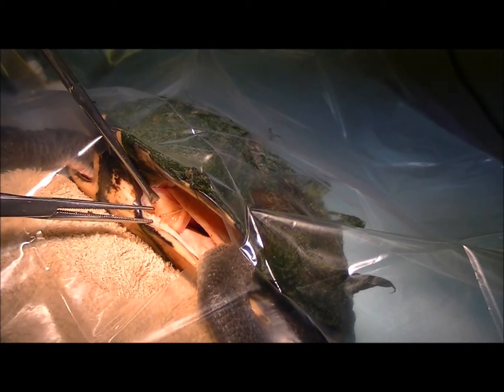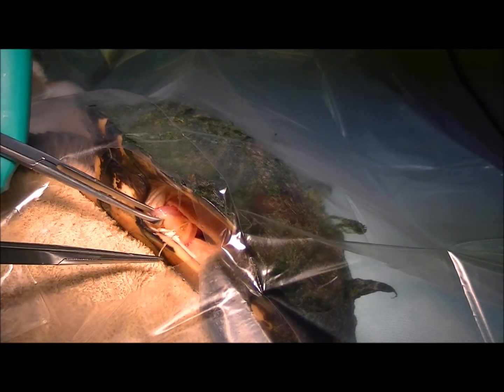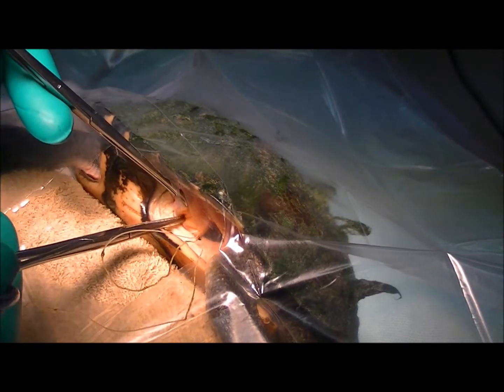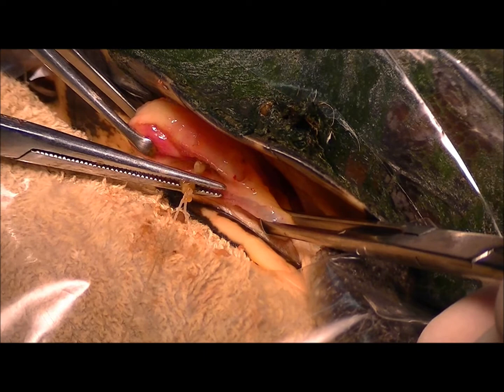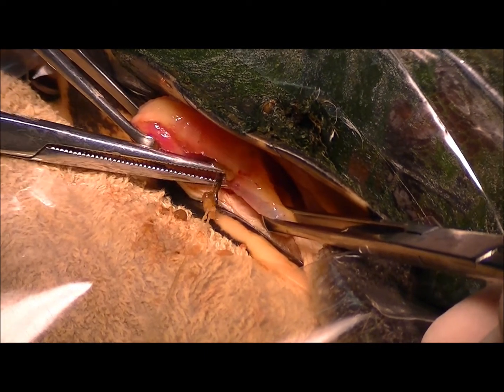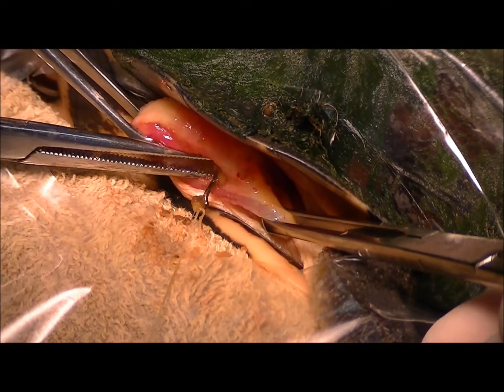So I've just popped a pair of hemostats — those are these instruments here — into the stomach, just trying to feel if I can feel the hook or not. And what I've actually found first up is a piece of fishing line, so as we pull that gently, obviously at the end of that is going to be our hook. So we need to follow that down and undo the hook from the wall of the stomach. You can see that line coming out — there's the knot at the end. This is the shaft of the actual hook here. I've just got to manipulate this and find out which way it's curved into the stomach wall so I can back it back out properly.